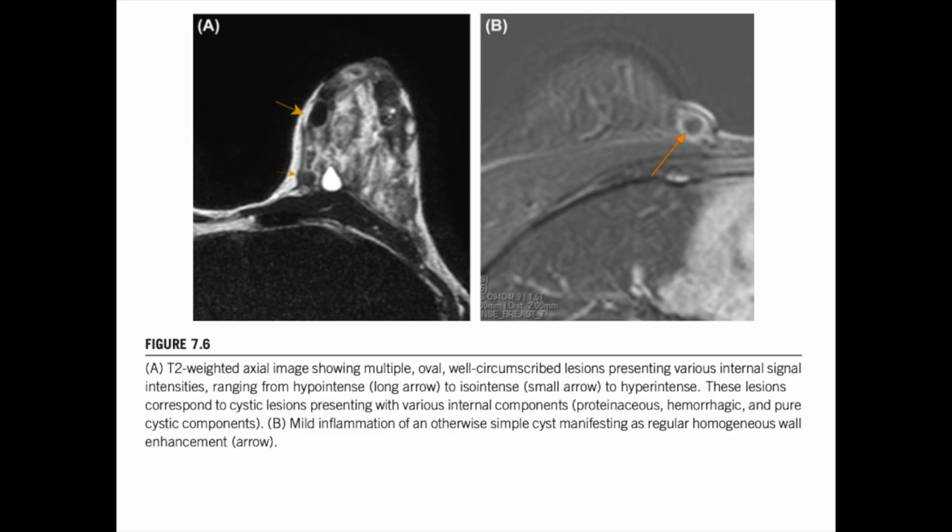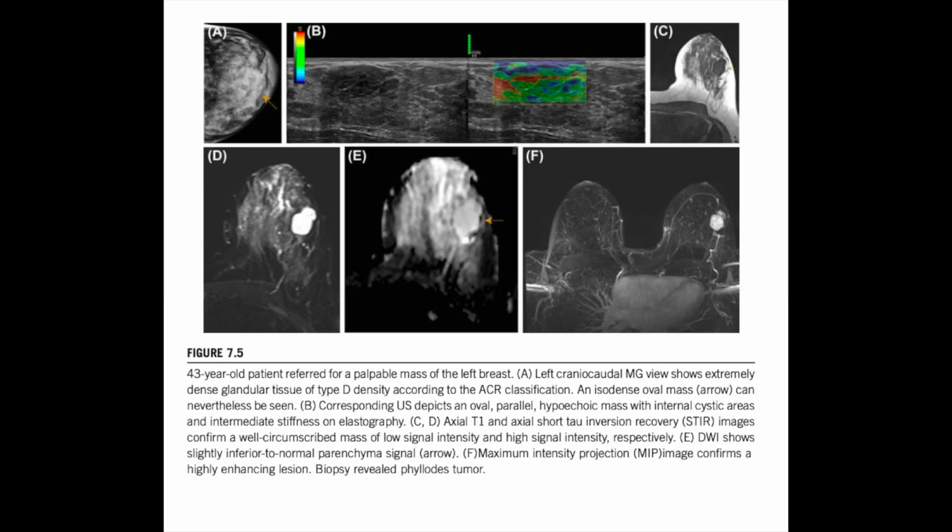So here's the final thought then. If we can quantify aggressiveness in a known cancer, why are we still using subjective visual curves to rule out harmless findings? It's a very powerful question. Could we see a future where the standardization of these advanced quantitative methods, like K-trans or some other biomarker, could finally give us the accuracy to definitively classify even the most ambiguous benign lesions? You mean like those tricky plateau curves or the cellular fibroadenomas? And truly, finally, eliminate every single unnecessary anxiety-inducing biopsy in the world.